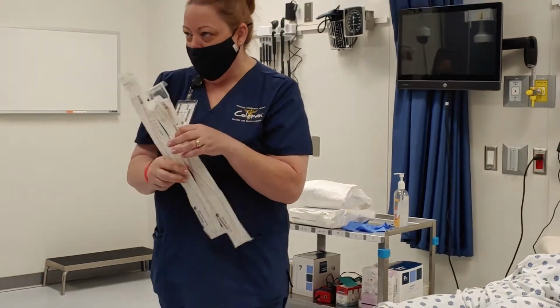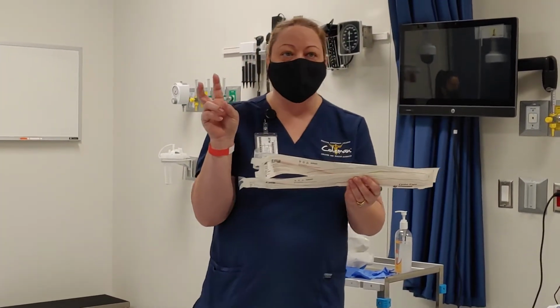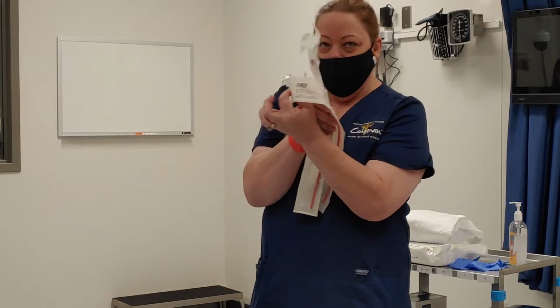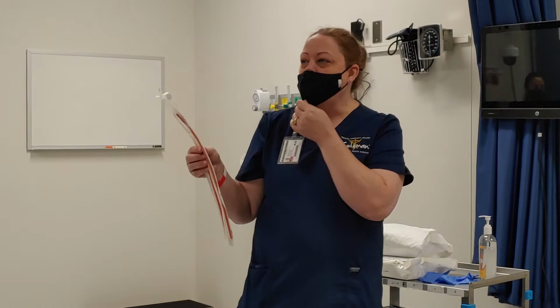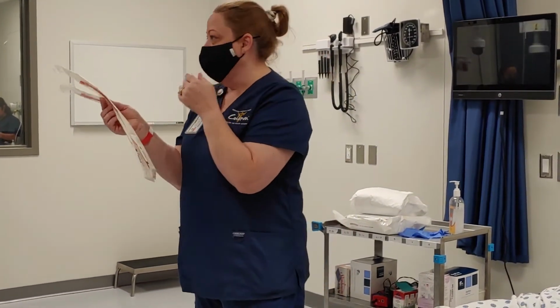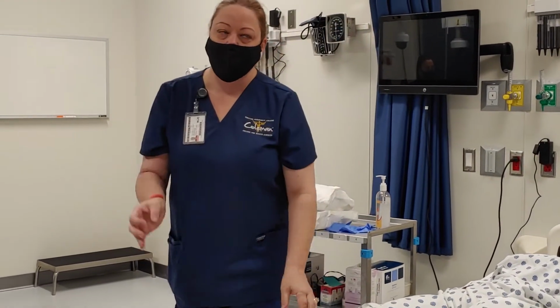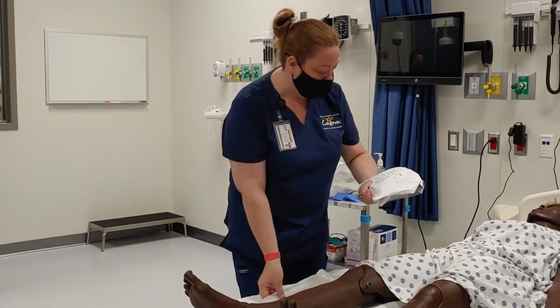Now, these are measured in sizes, and the size is called a French number, French. So both of them are actually a 14 French, and that's just telling you the different size that they have. So it's not measuring, hey, this is a size 14 and this is size 16. All right, it's a French 14 or a French 16 or whatever it is that you're using. So I will pass those around. Again, these particular kinds are only used as a straight catheter, not one that is going to remain in place.